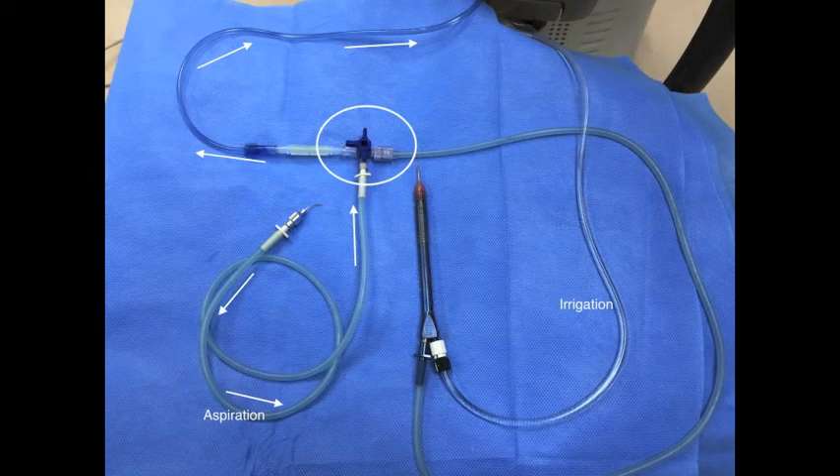With the three-way tap now turned to this position, the aspiration will come from the mini-aspirator and go towards the three-way tap, bypassing the aspiration from the main handpiece.